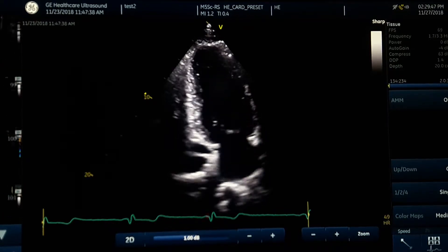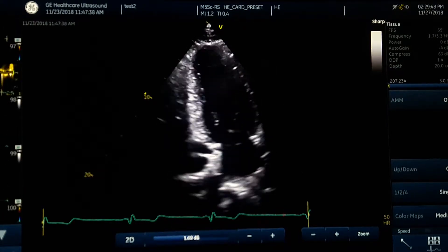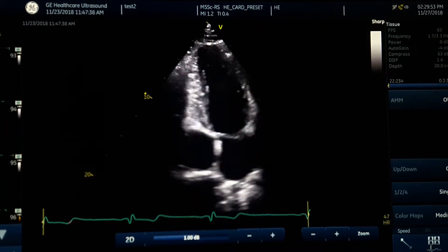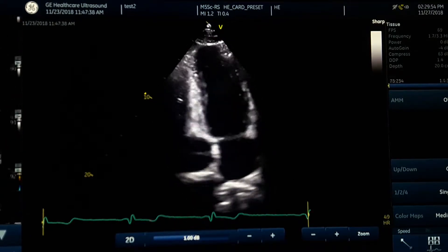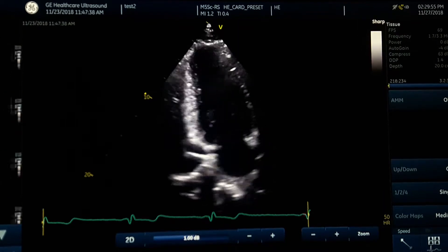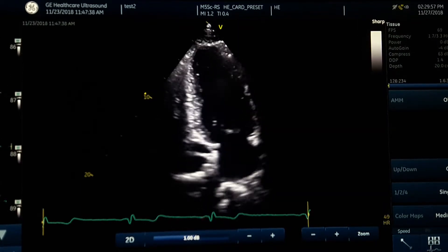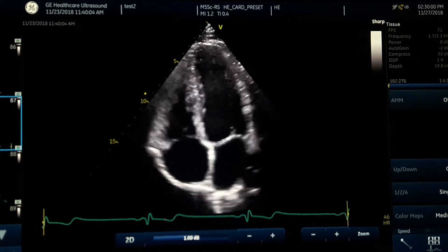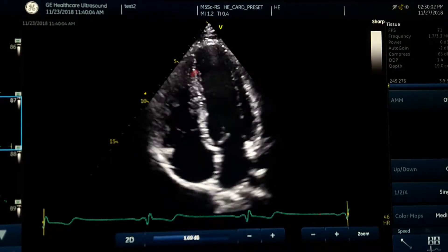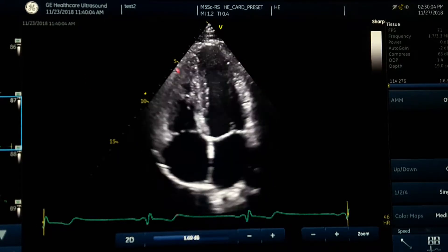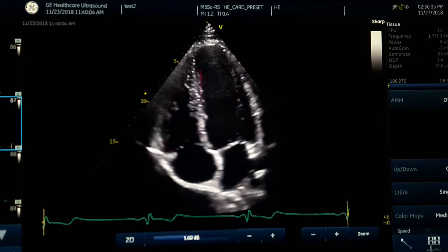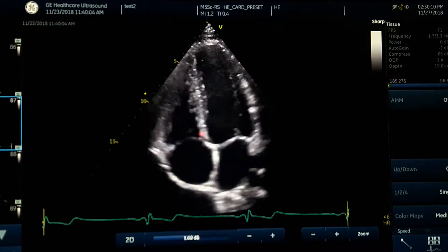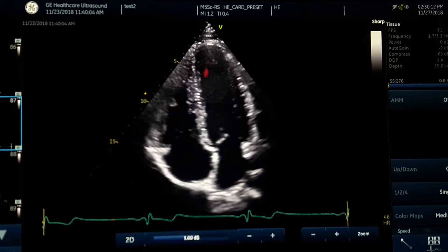Starting from a good Apical 4 chamber view, the most important thing to get the Apical 2 chamber is to bring the septum to the center of the image. In this case it is not at the center — it is a little oblique. Make it vertical with just heel-toeing and slide the probe a little medial.